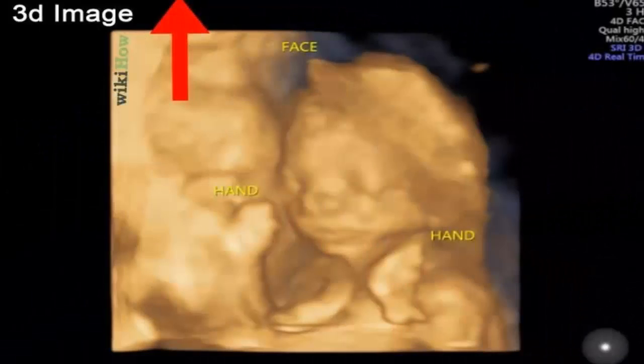If you want to have a 3D or 4D ultrasound, the best time to do so is between 26 to 30 weeks. Keep in mind that these scans can be quite expensive and may not be covered by your insurance unless there is a medical reason to have one done, such as to investigate an abnormality.